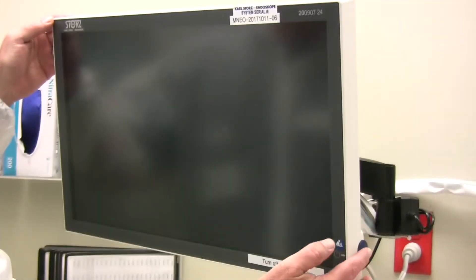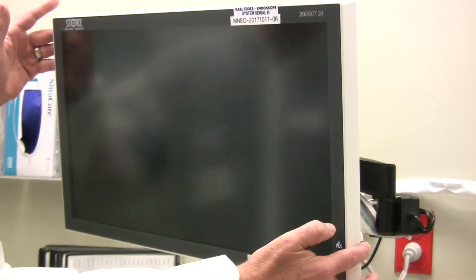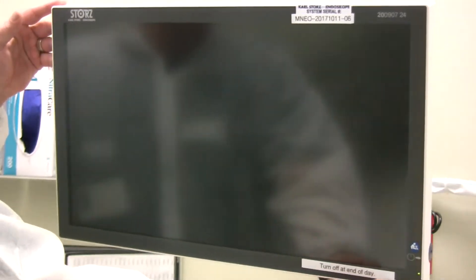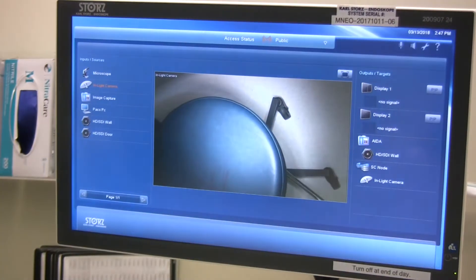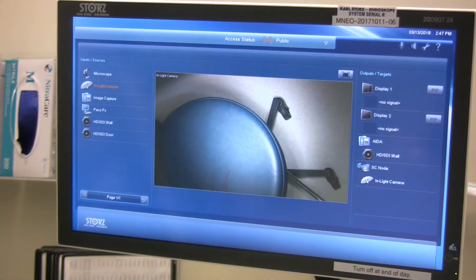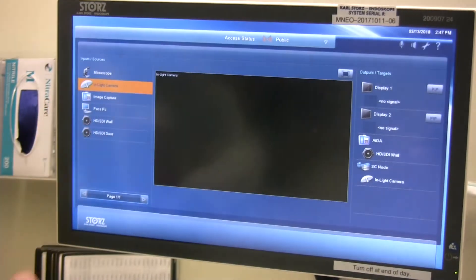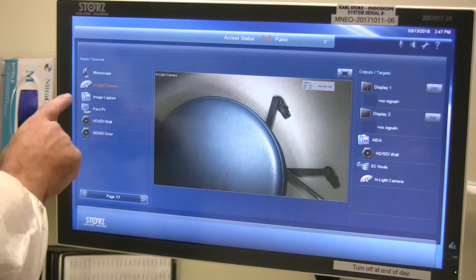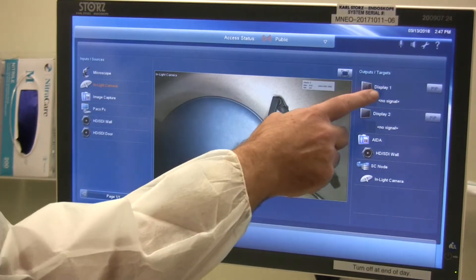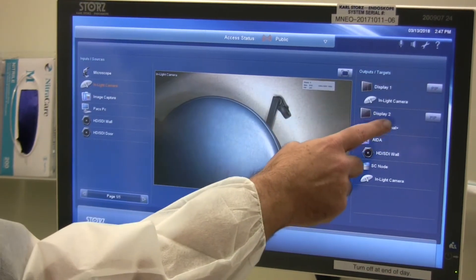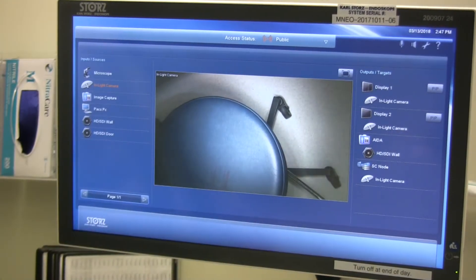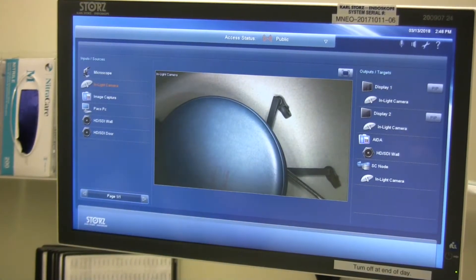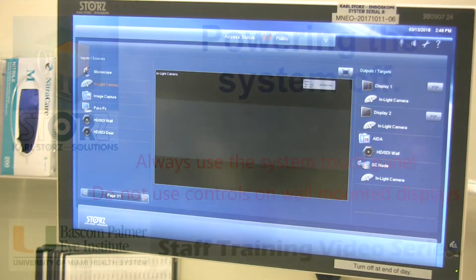At the start of each day, the system is going to be asleep. To activate or wake the system up, on the bottom right-hand corner there's a blue power button. Press that to activate the touch panel display. Once activated, we're going to select a video source — in this case the in-light camera — and route that to Display 1 and Wall Display 2, activating both wall displays. Now you're ready for video routing and general operation.